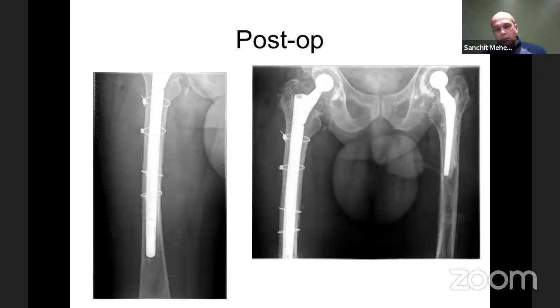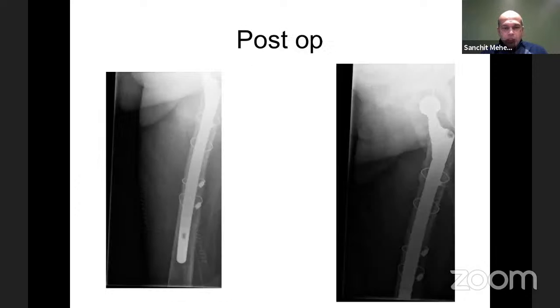In this case, you can see that we've achieved fixation over a long length around the isthmus, and the tube has been restored, which is why we did not need a plate in addition to this. This is the curved Revitan stem. The good thing about this stem, which is something to bear in mind when you have your revision inventory, is that on the larger sizes of this conical stem, you have distal locking options. So in cases where the isthmus is not giving you fixation, or you have to go long on the 260 stems, that distal locking option sometimes gives you further security, especially in the elderly osteoporotic bone.